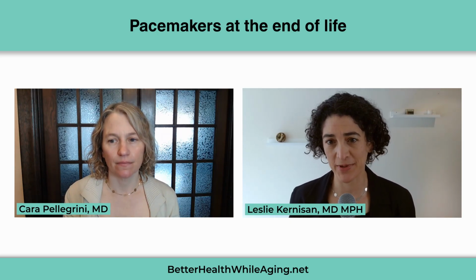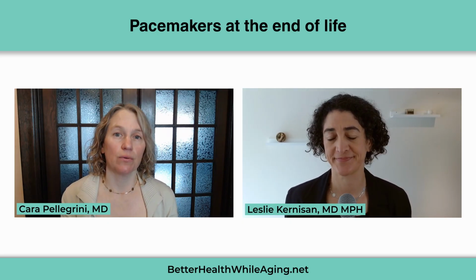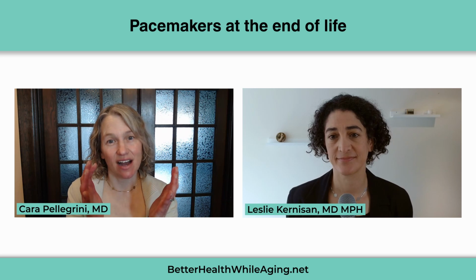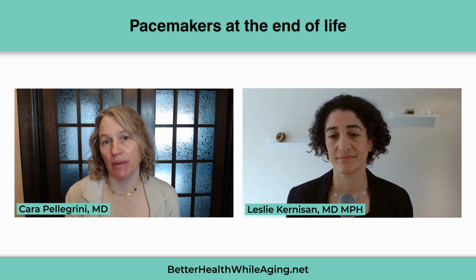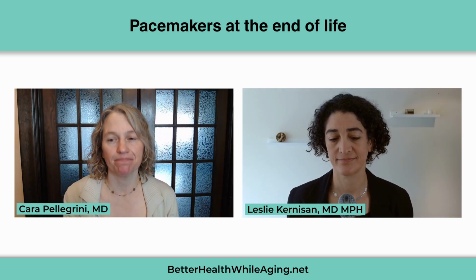Yeah, but as you were saying, that fast, life-threatening arrhythmia is kind of your heart suddenly stopping, which is one way that people sometimes might think is not such a bad way to go. Correct, if we are in that end of life stage. So if the heart goes really fast like that, and that basically causes the pumping to stop, that's very often felt to be a quick, painless way to go, sudden cardiac death, and so people quite reasonably sometimes choose to have that device turned off.